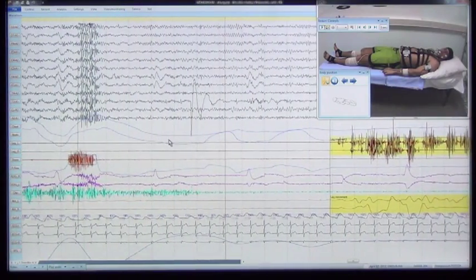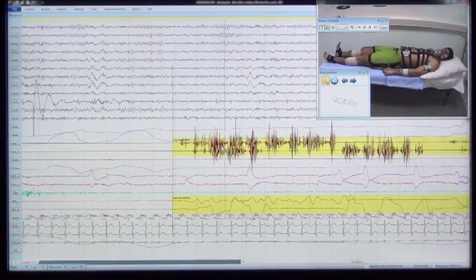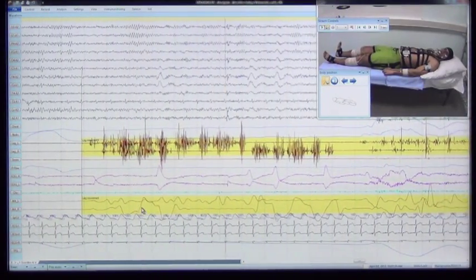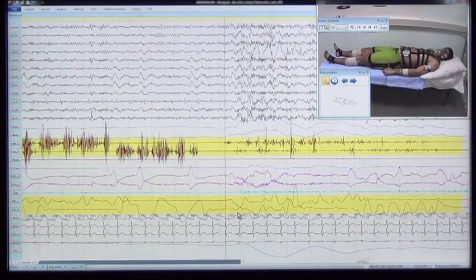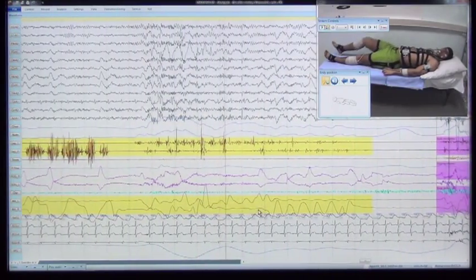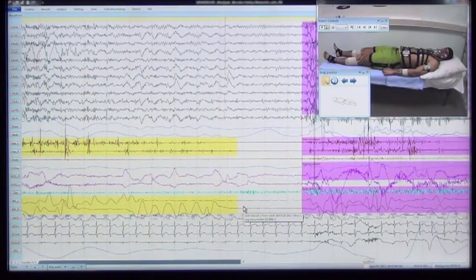Breathing management is demonstrated. Limb movement produces responses in the EMG channel of leg muscles and in the wireless movement sensor channel. Limb movements in the knee joints are also demonstrated.